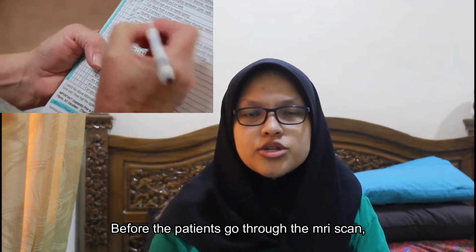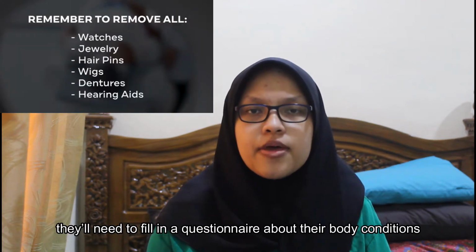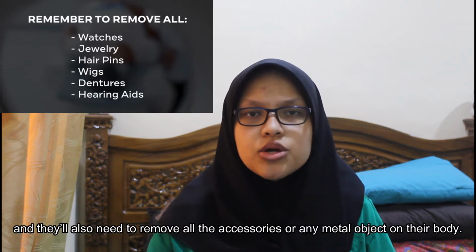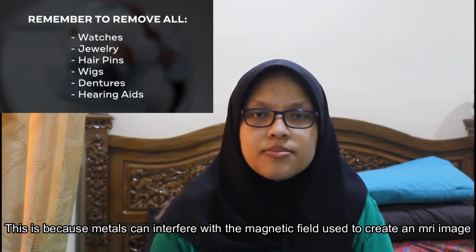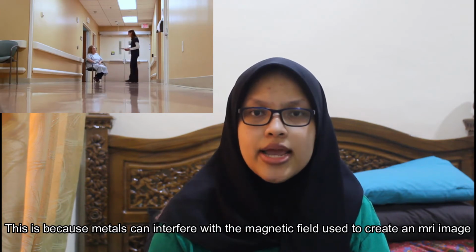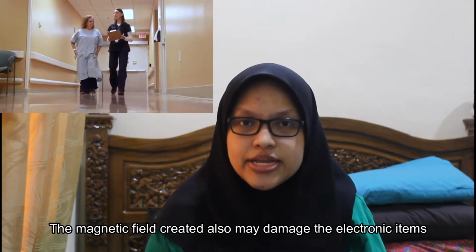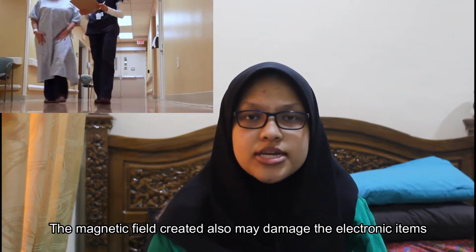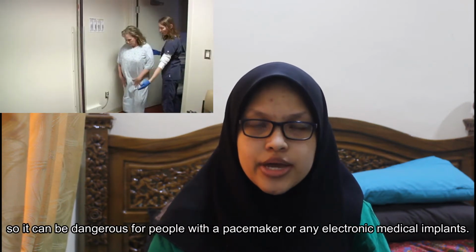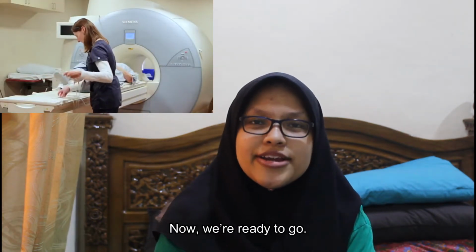Before the patient goes through the MRI scan, they will need to fill in a questionnaire about their body condition, and they will also need to remove all accessories or any metal objects on their body. This is because metal can interfere with the magnetic field used to create an MRI image and cause a safety hazard. The magnetic field created also may damage electronic items, so it can be dangerous for people with a pacemaker or any electronic medical implant. Now we are ready to go.